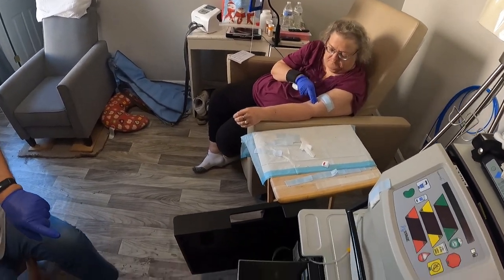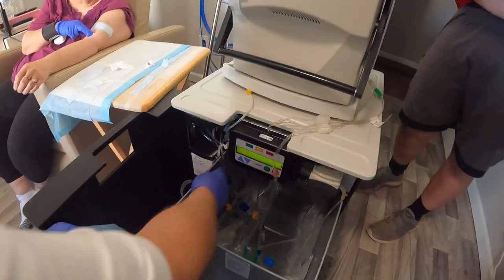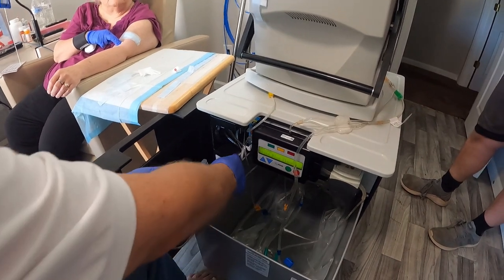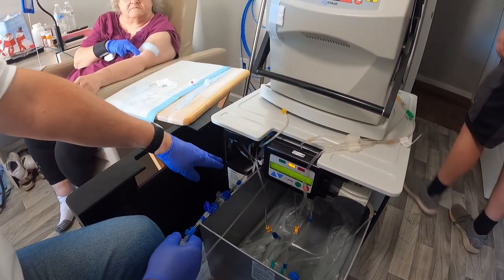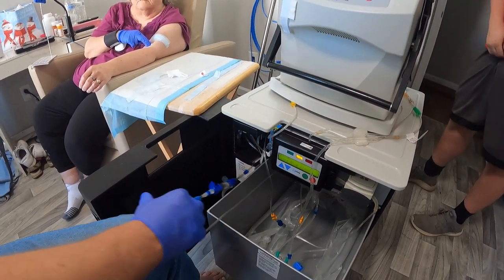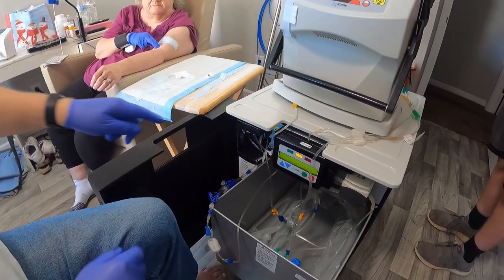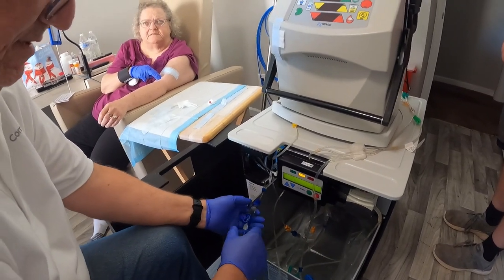So you see here, our instructions have changed. Closed blue clamps. This is input. This is where the water comes from. This filter has to be changed out every so often; it'll tell you when. If you look in there, there's a big box about that deep. It's got one of those filters in it. Oh, okay, and it goes inside. Yeah, it's a water purifier.